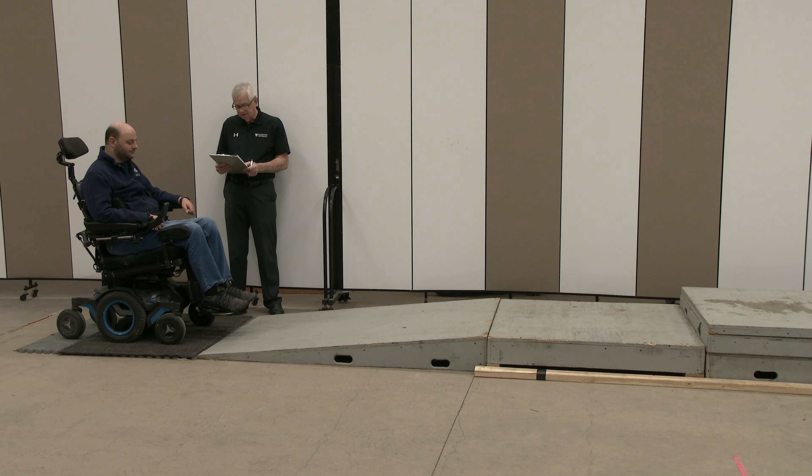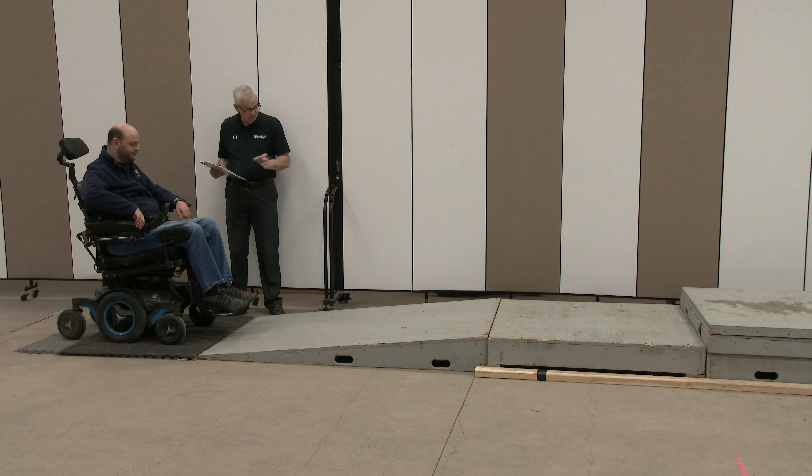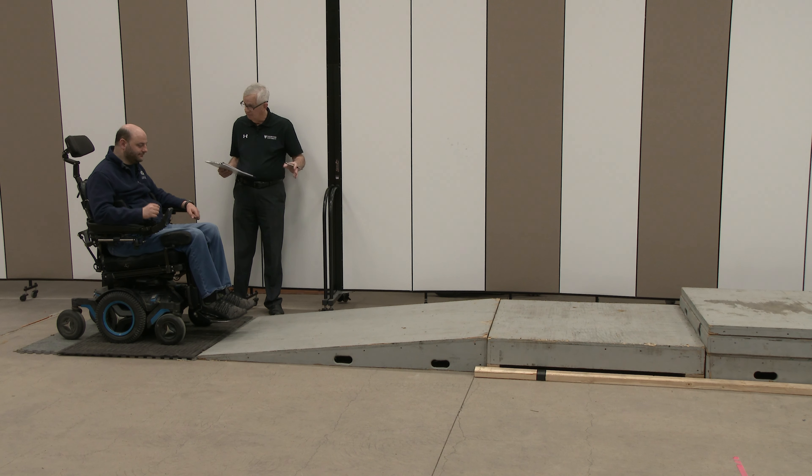Skill number 20: ascends slight incline. If we can get your chair up onto the platform, maybe stop part way.